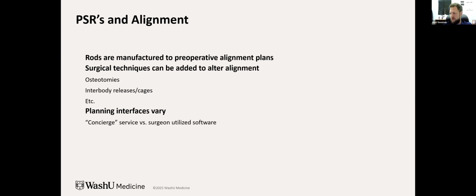And what about 3D printing? So 3D printing is not going to have the same kind of surface stresses, but the roughness of the material, it depends on the kind of 3D printing, but essentially if it's sintered titanium, the way the titanium melts together or sinters together is going to produce a different kind of material that will affect the way cracks propagate through the titanium.